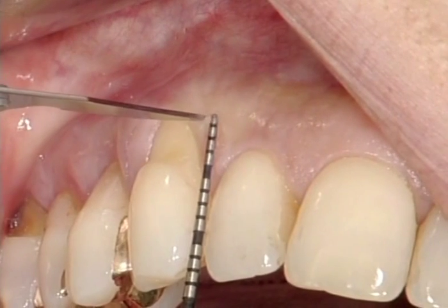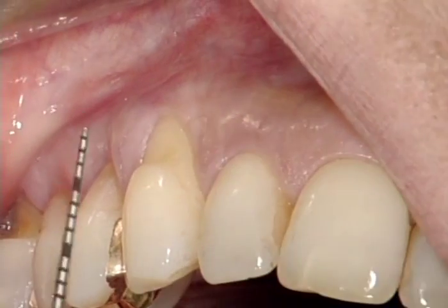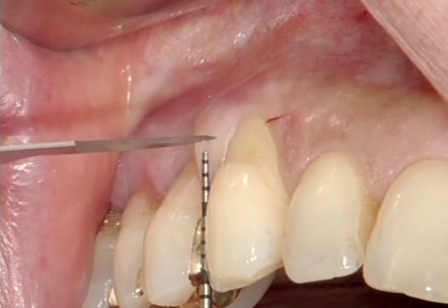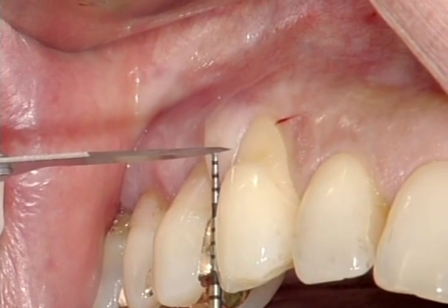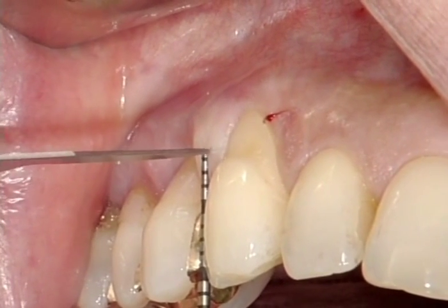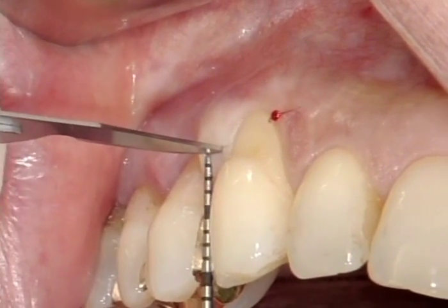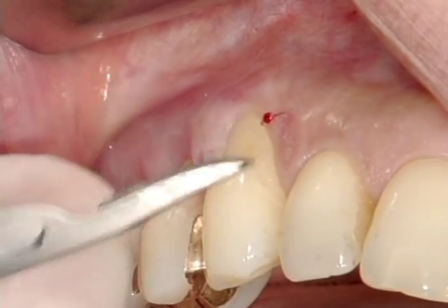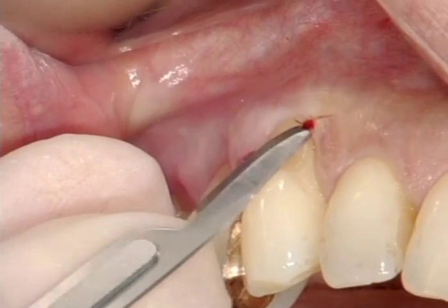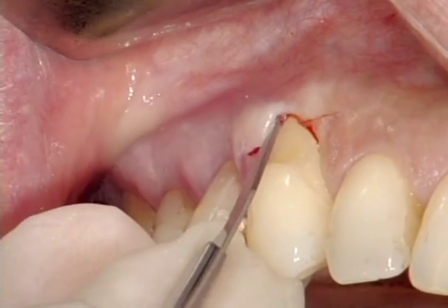The area has been anesthetized by local infiltration. The horizontal incision, using a 15C blade, is extended to the adjacent interdental areas a few millimeters coronally to the soft tissue recession margin. Then a sulcular incision is done.